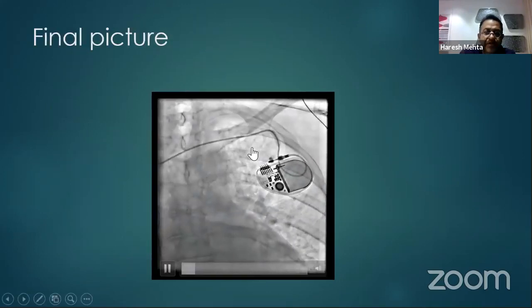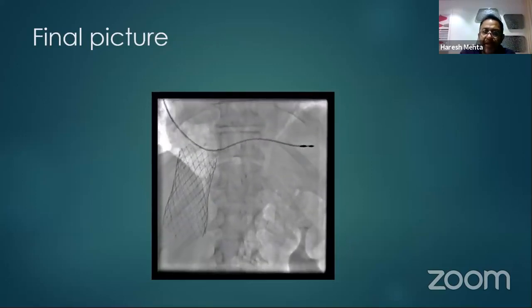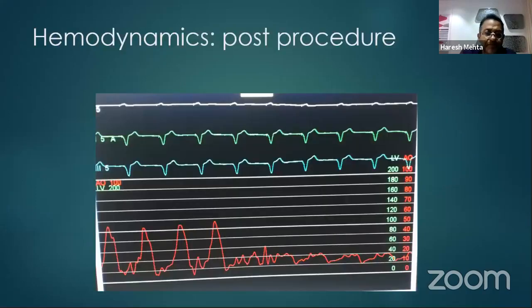And as has been discussed, with a pacemaker in, it can easily be implanted despite the pacemaker lead being in. It doesn't damage the lead. And now you see the pull back from the RA into the vena cava. You can see that the pressure has totally gone down, clearly telling us that this patient is now going to benefit from reduction of hepatic congestion.